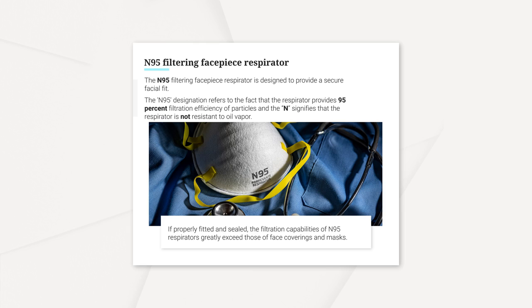The N95 designation refers to the fact that the respirator provides 95% filtration efficiency of particles, and the N signifies that the respirator is not resistant to oil vapor. If properly fitted and sealed, the filtration capabilities of N95 respirators greatly exceed those of other masks described in this course.